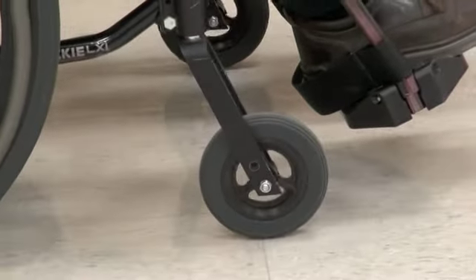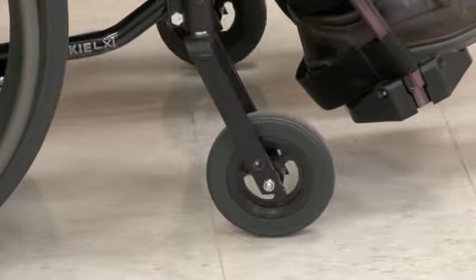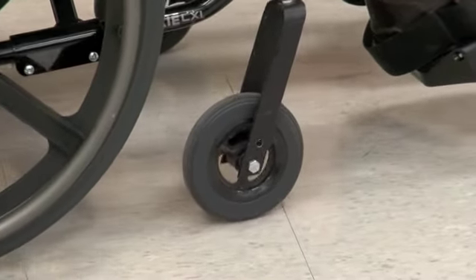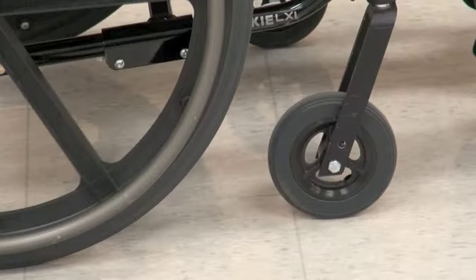When you propel backwards, your casters will swivel around and follow pointing forwards. When you turn, your casters will also pivot sideways. This is very important for understanding how to operate your wheelchair effectively.